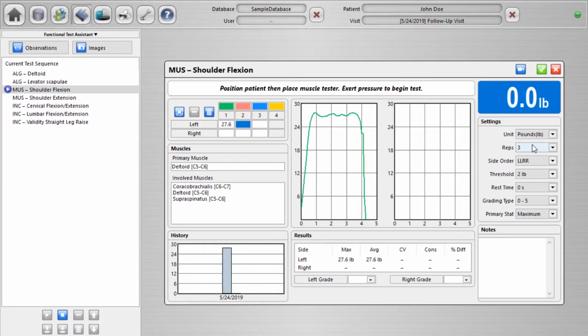There are definitely best practices when performing objective assessments, making sure the patient is familiar with what it is that you want from them, what kind of performance you want, making sure that they understand fully the nature of the test, perhaps even giving them a little bit of practice so that they can give you the best results. All of these things contribute to making sure that the objective data is as clean as possible, trying to eliminate any additional unnecessary subjective factors.